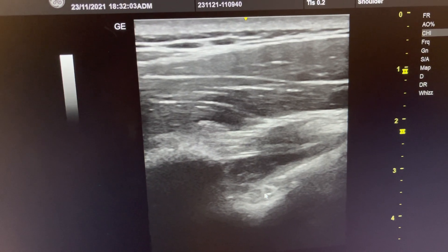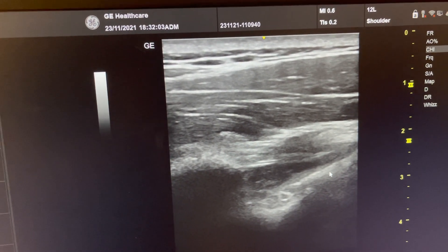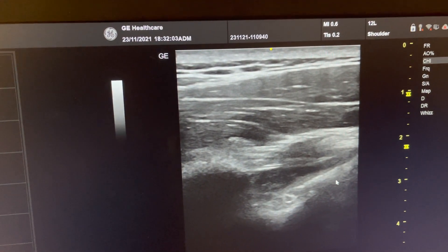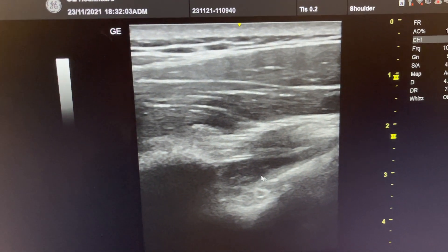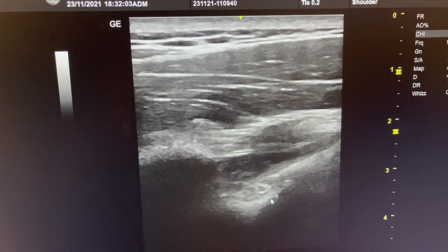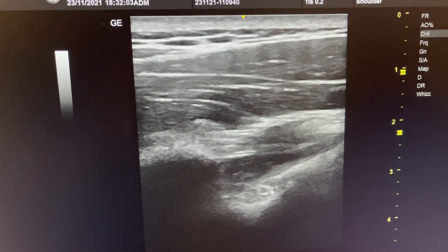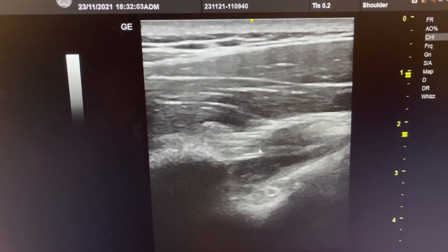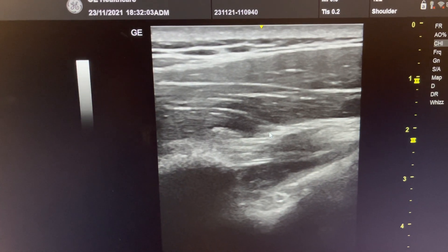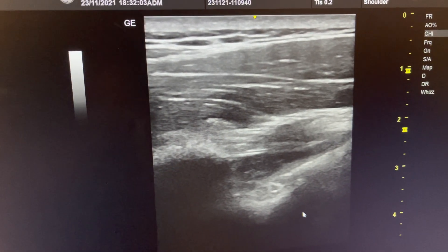In this notch you have the suprascapular nerve, and the suprascapular nerve here can be entrapped because of labral tears. Fluid can come out and form a cyst right in this location, so that's why it's important to look here for any cystic structures that compress the nerve. Usually they give a loss of strength of the infraspinatus. And that's the infraspinatus.